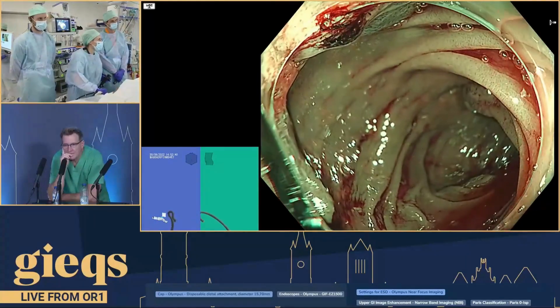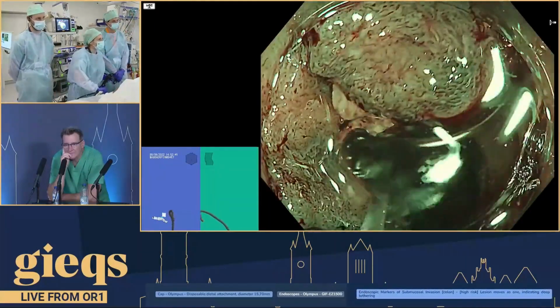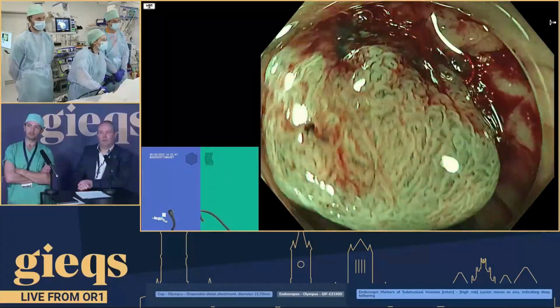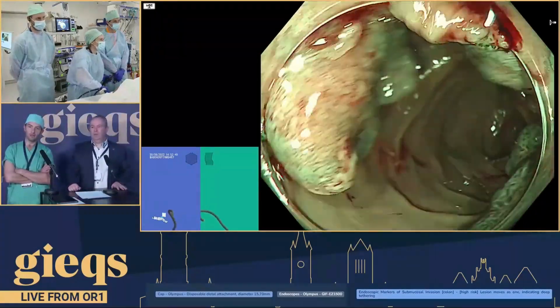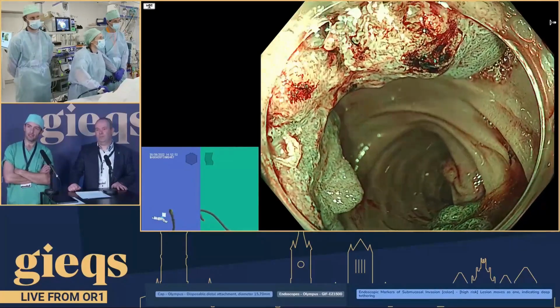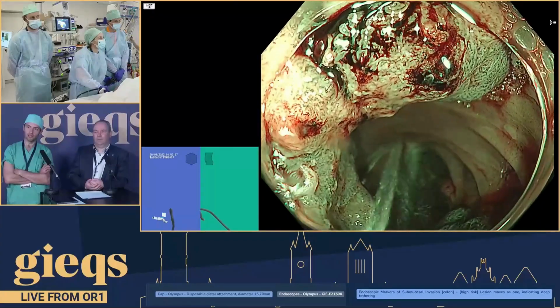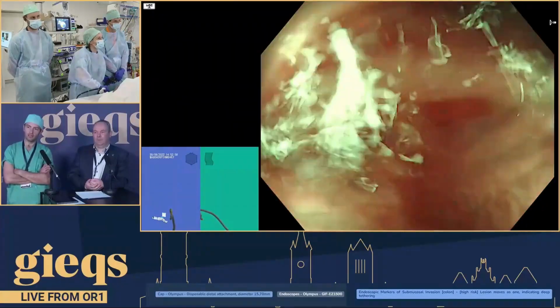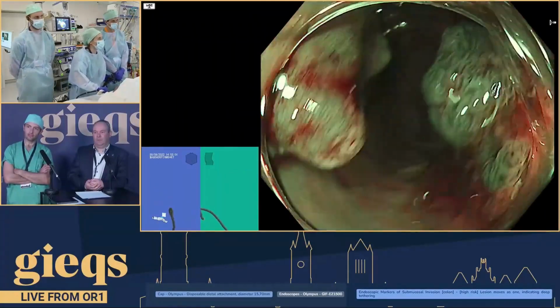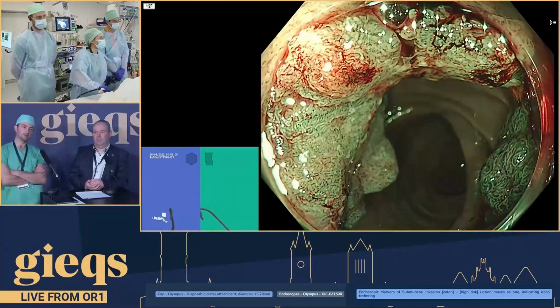And at the back, we see clear evidence of cancer. It gets even worse. So can I ask you a question, everybody in the room, and some suggestions about this? Maybe we start with Ralph. Why this patient was scoped at our hospital, I will declare that. And the patient had a full colonoscopy and was referred from one physician to another with the diagnosis of 2 pedunculated polyps in the sigmoid. So how has that happened?